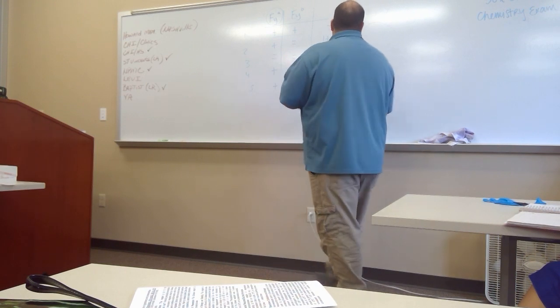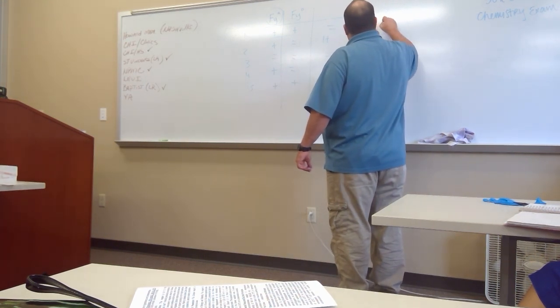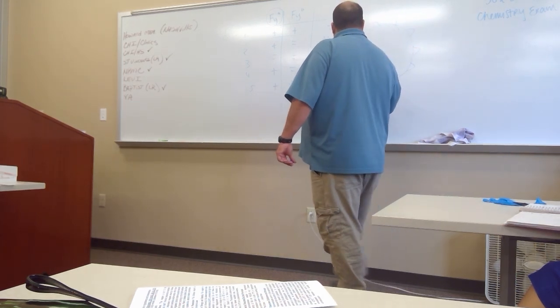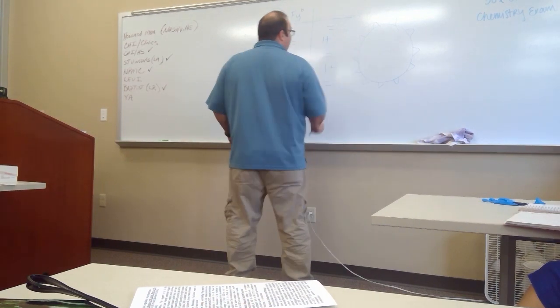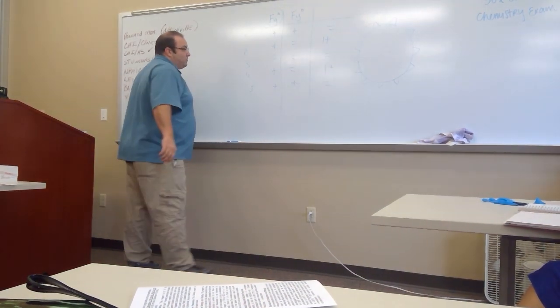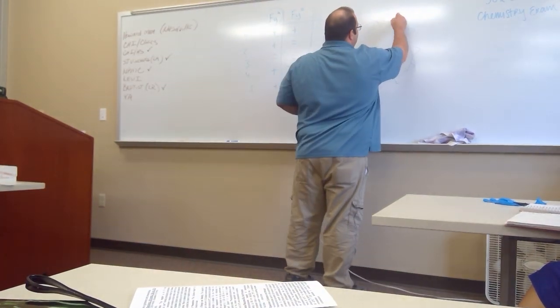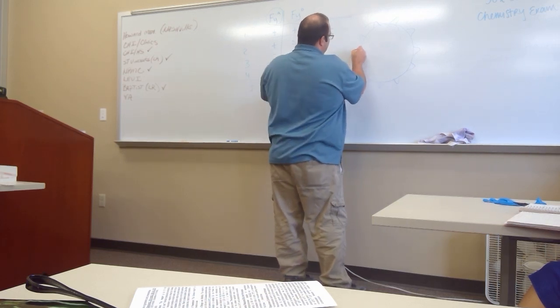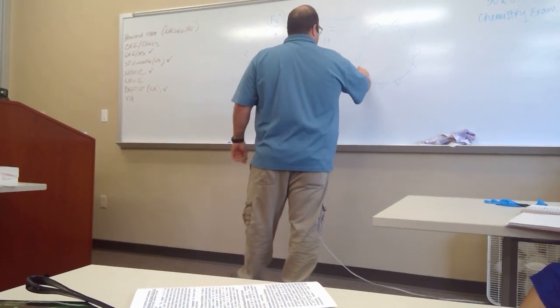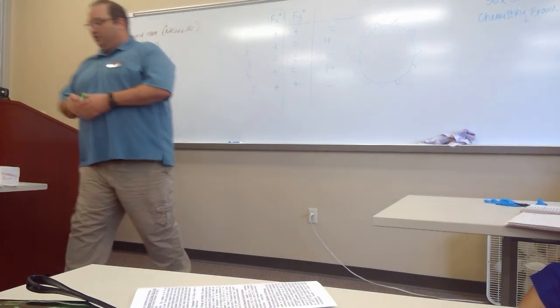But like I said, when you're talking about these dosage ones, if blue is Duffy A, it's got all the room in the world to do what it wants to do if there's no Duffy B. You start adding a bunch of Duffy B, and now it doesn't have a stronger reaction because there's less of it.